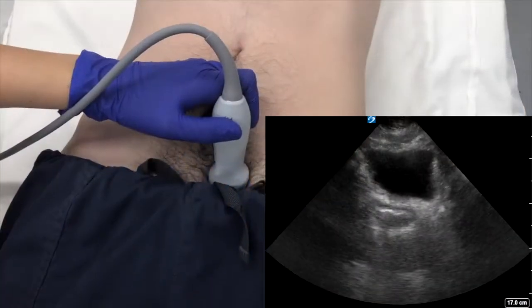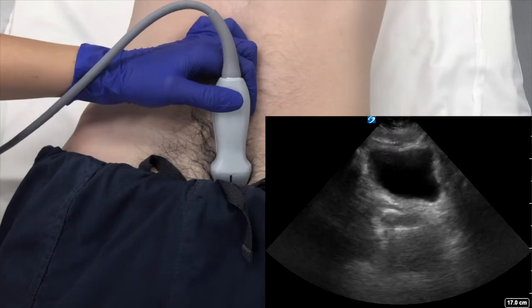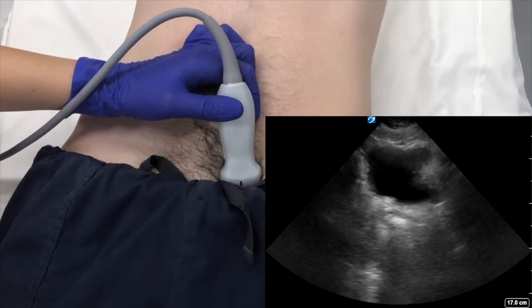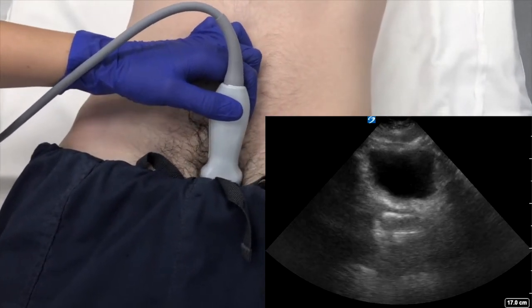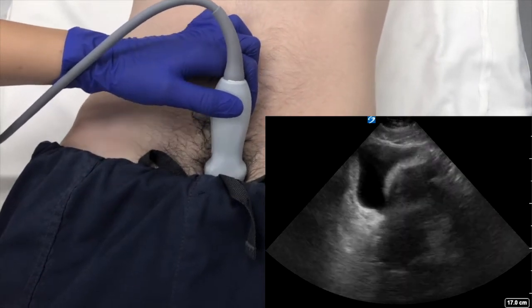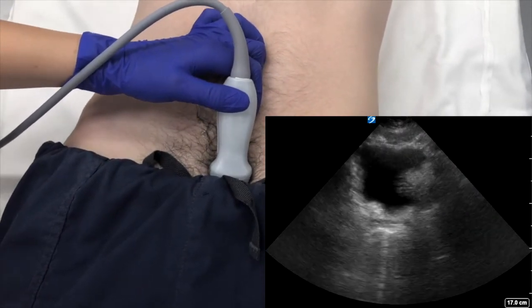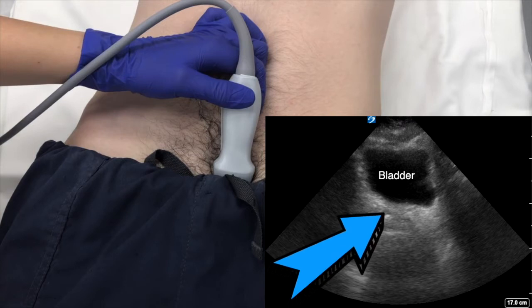The pelvic space is viewed with the probe just above the pubis oriented horizontally with the probe marker pointed towards the right. The bladder provides an excellent acoustic window when it's full. The probe is then maneuvered in a sweeping angle through the pelvis evaluating posterior to the bladder in the dependent space. Any dark area posterior to the bladder is indicative of blood.